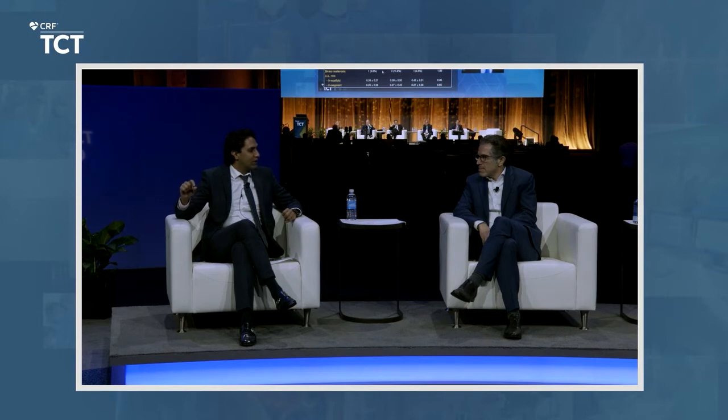Because in the really tight, heavily calcified segments, Shockwave is going to break it and create calcium fracture. But it's still a balloon. So in the other areas where it doesn't need calcium fracture as much, it's still going to let you expand the stent. And the two most important messages are the mean stent expansion and the minimal stent expansion at the maximum calcium site. They're more than 100%. So it's working. So I think we shouldn't worry too much about the eccentric versus concentric because we get consistent results.